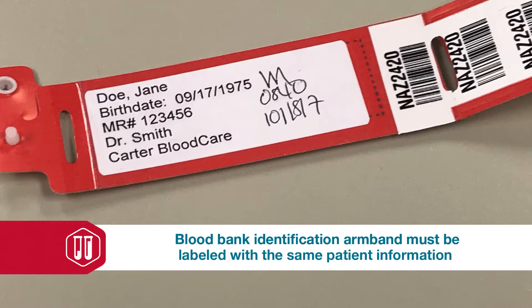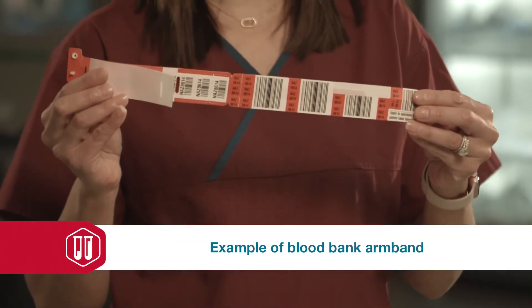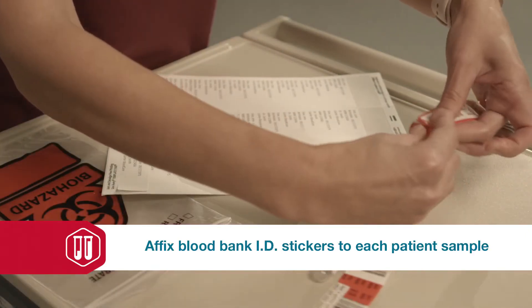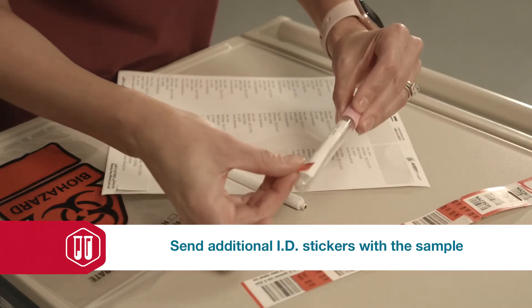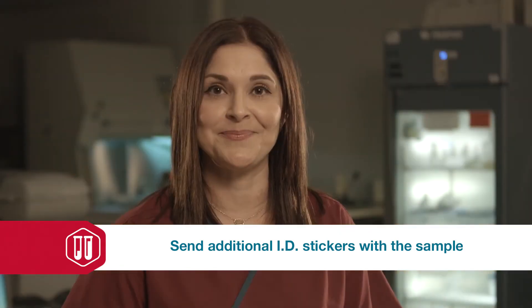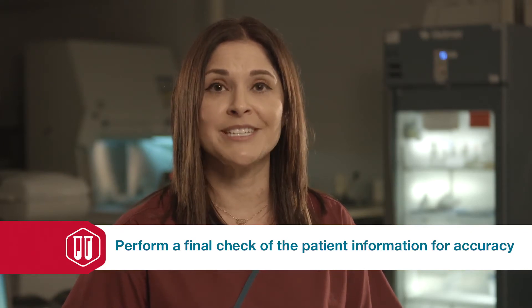Additionally, if your facility uses a blood bank identification armband, then you can either use a pre-printed label or handwrite the information on the blood bank ID band. Here's an example of a blood bank ID band. Please remember that there are additional stickers on the armband that must be affixed to each sample collected. Send all additional ID stickers with each sample collected, and remember, once properly labeled, the blood bank identification armband should remain on the patient.